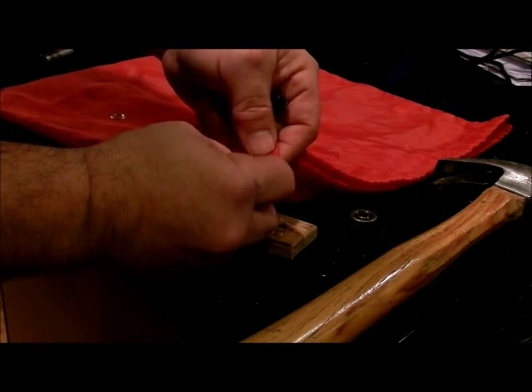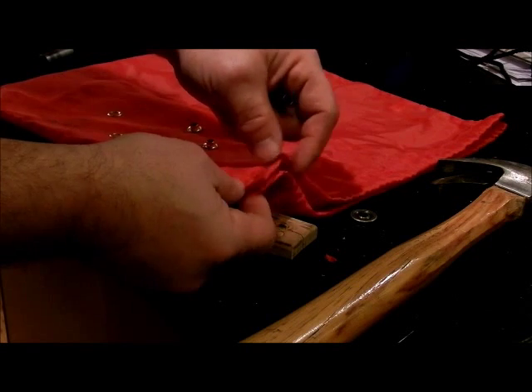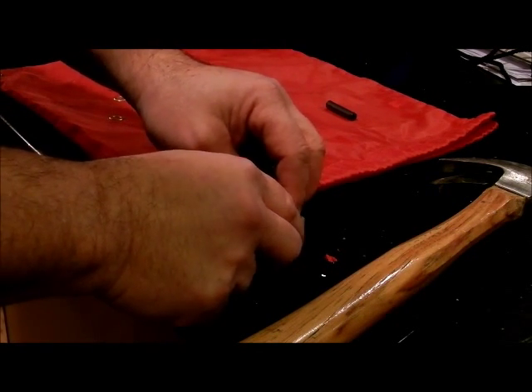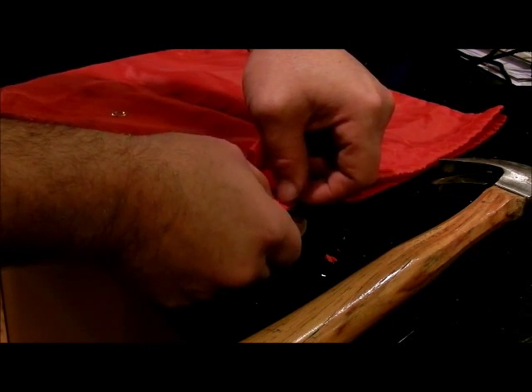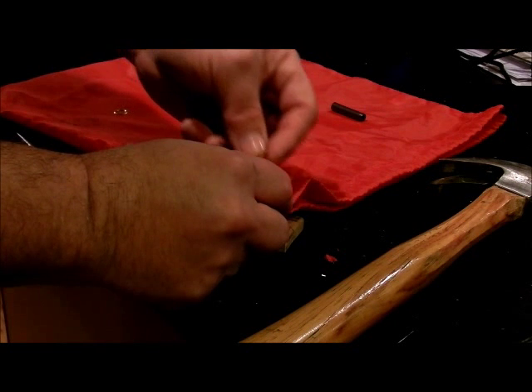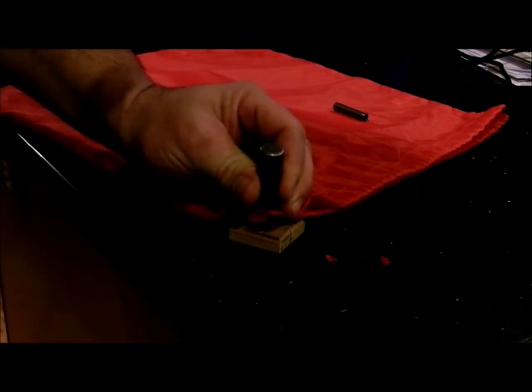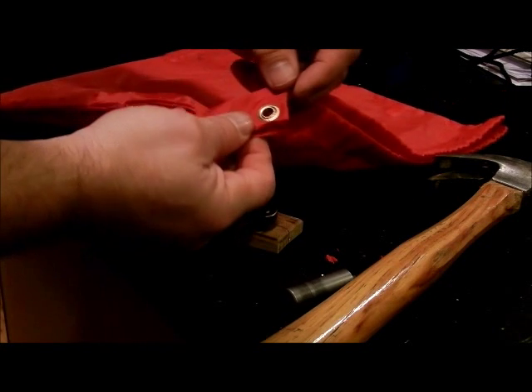Got one out. I'm not worried about that. They just come right out. It's all nylon, very cheap nylon. So I put this on the bottom, put our grommet inside, put our hole over it. We'll put the first hole through, put the second hole through. Put the outer grommet on. Put the thing in, and here we go. And there's our grommet.